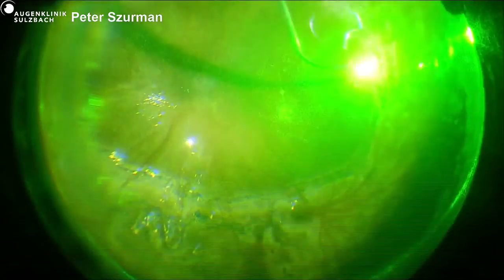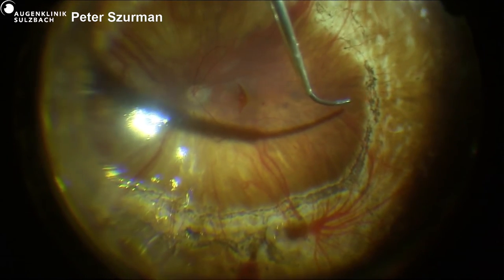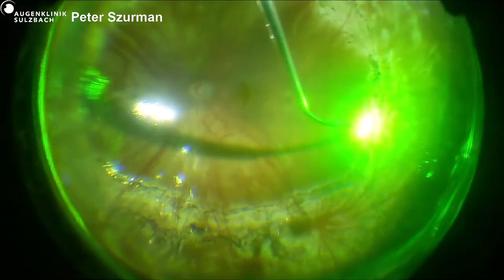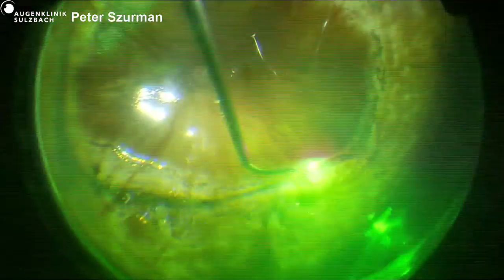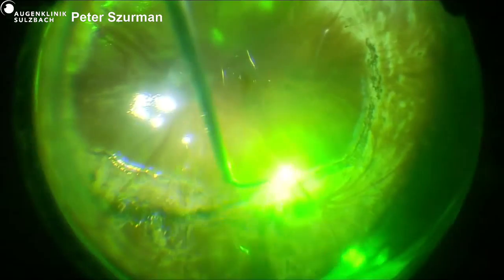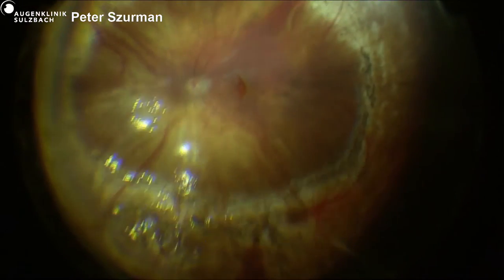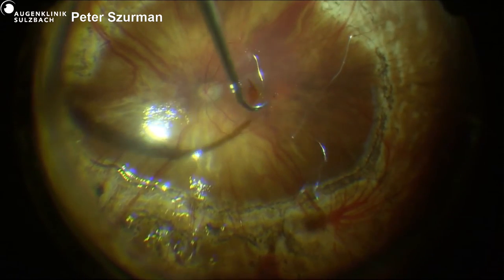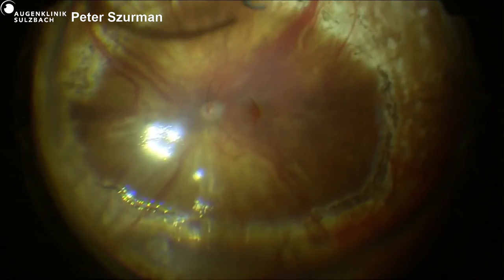Very good. We will come right back, but I would like to go to OR4 for a moment. If we can go to Peter Szurman. And so, Peter, now you have completed the ILM peel around the irregular macular hole, and you are reinforcing the previous endocerclage. Are you planning to laser the macular hole?